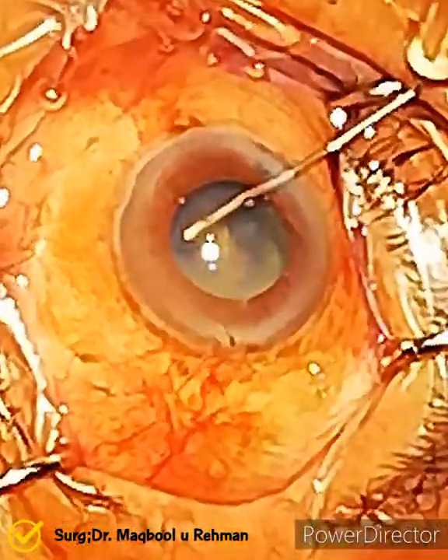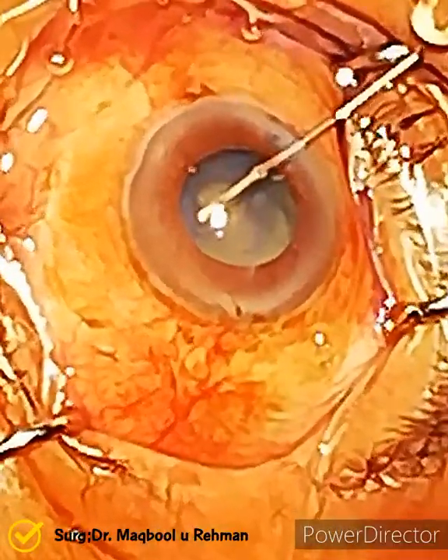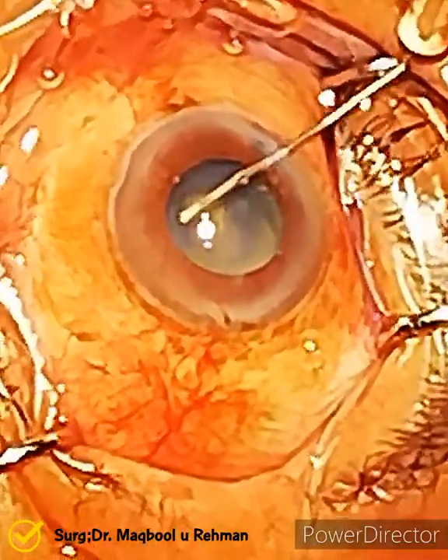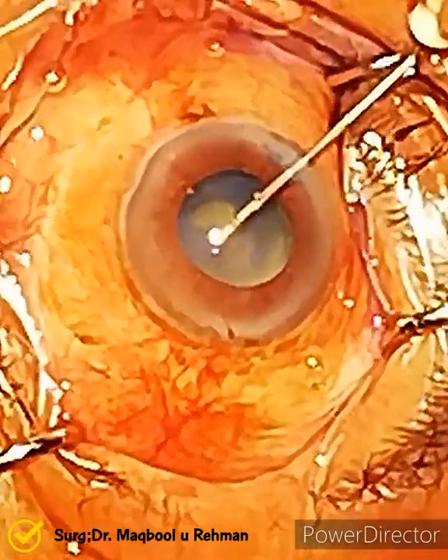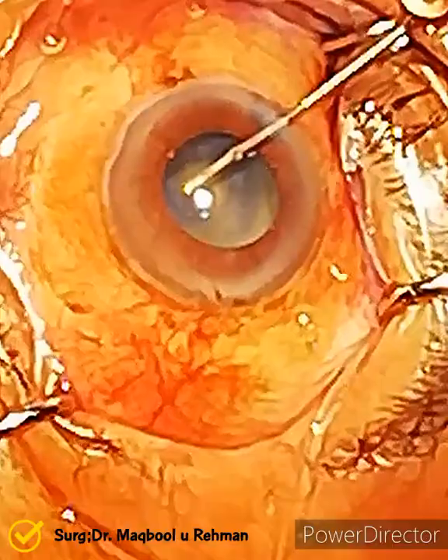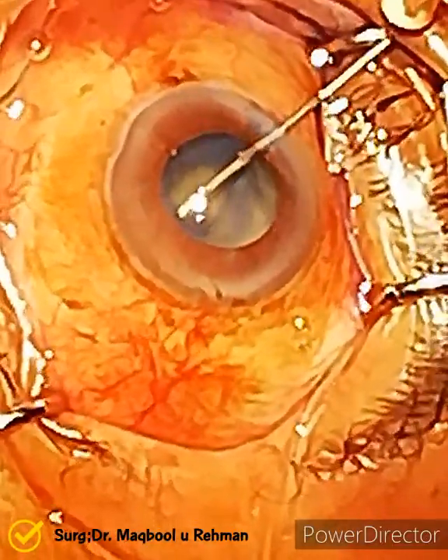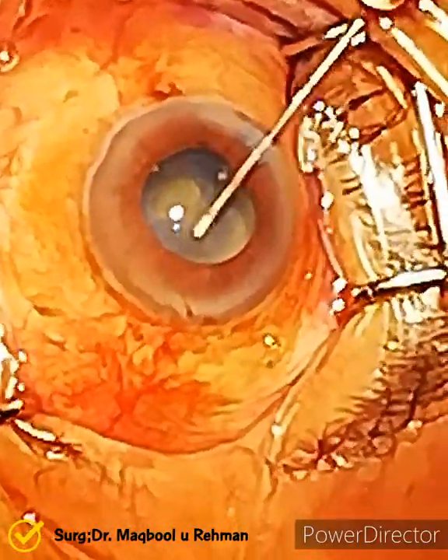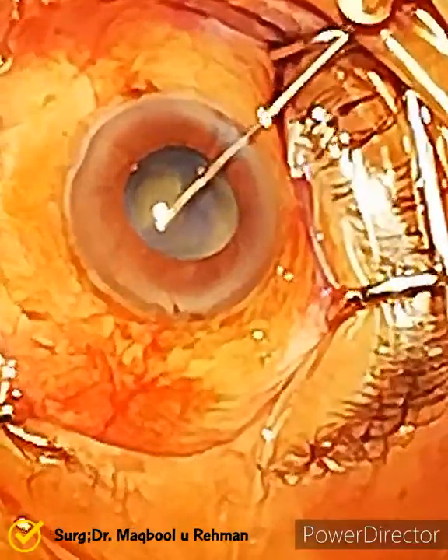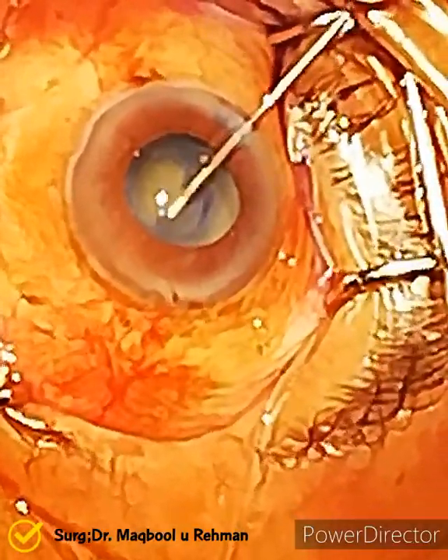Now he is trying to make the capsulorrhexis with the cystitome. Going well up till now — the surgeon is doing very well. There is no anterior capsular fibrosis, which is a good sign.